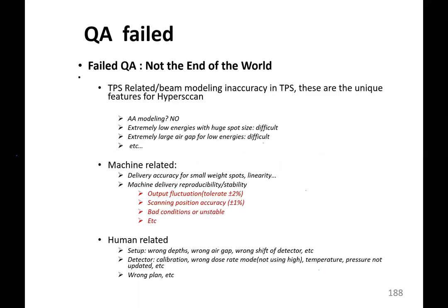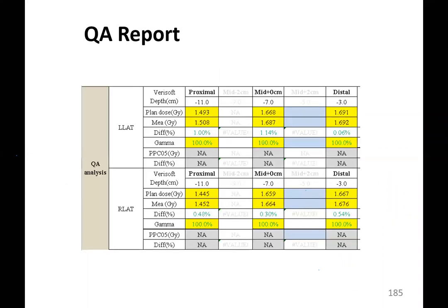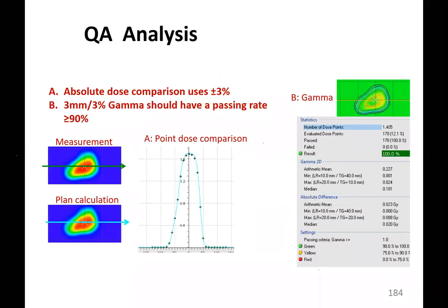All right. Thank you, sir. And secondly, just a quick question. Are you doing the patient-specific quality assurance for every patient? Yes, we do for every patient. That's what I showed you over here. Are you skipping after getting enough confidence, just like for IMRT? No, we are not skipping. You know, there is a lot of uncertainty in proton therapy, so that's why we are not skipping it. No center is skipping it. Every center is doing patient-specific QA. As I mentioned in the previous slides, there are uncertainties. In order to overcome those uncertainties, we are doing the patient-specific QA.